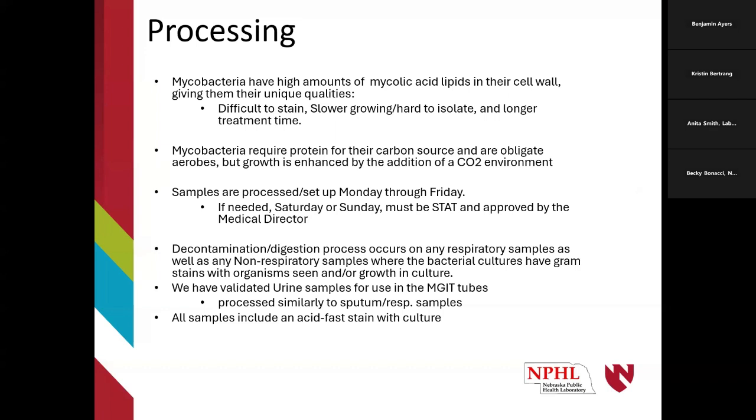We go through a decontamination and digestion process, and this is typically done on all respiratory cultures and any non-respiratory cultures that may have a gram stain that has bacteria or organisms, and/or if there's growth in these cultures. So it's kind of nice to know if you're sending us samples whether they are growing bacteria, but we'll take care of that when we get it.